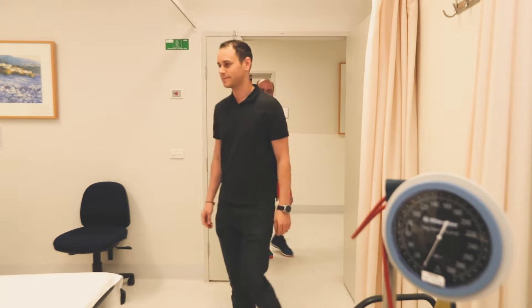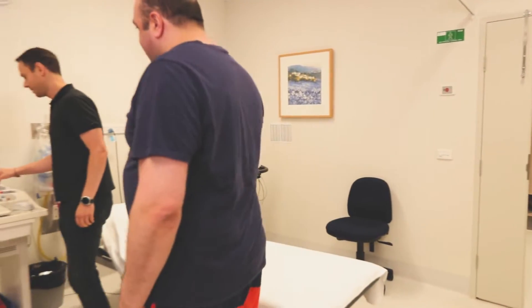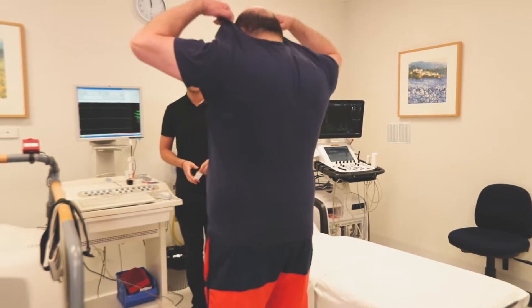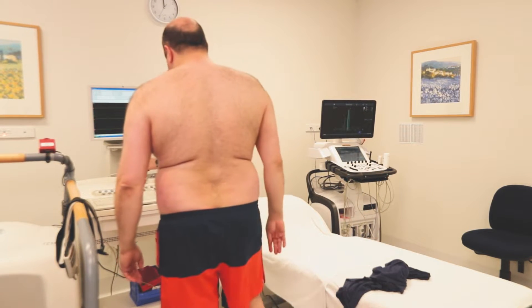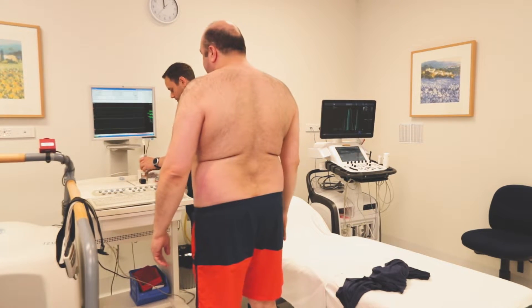A stress echo test is a procedure that determines how well your heart and vessels are working. It assesses the likelihood that you have significant narrowings in your heart arteries by comparing your heart function before and after exercise.